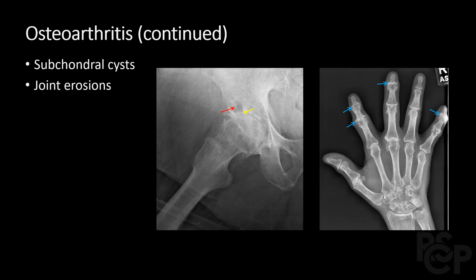Some final points about osteoarthritis. The red arrow represents a large subchondral cyst in the right acetabulum. The yellow arrow represents severe right hip joint space narrowing, most pronounced superiorly, unlike rheumatoid arthritis where joint space narrowing is more uniformly concentric. The blue arrows show areas of erosive osteoarthritis involving the PIP and DIP joints. It can be easy to confuse this for erosions from rheumatoid arthritis, but unlike rheumatoid arthritis, there is involvement of the DIP joints with corresponding osteophytes and subchondral sclerosis.